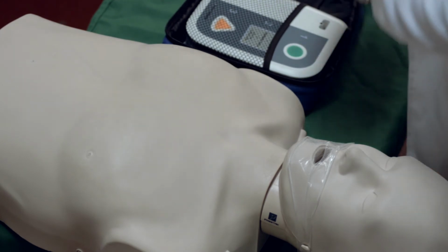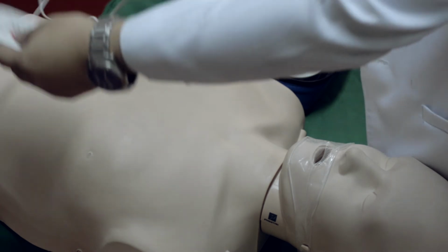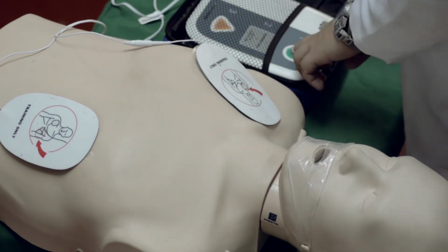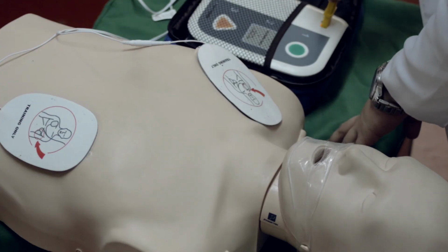Plug in pads connector next to flashing light. After applying pads to the patient's bare chest, we will plug in the connector to the AED machine or device. Now we plug it in.